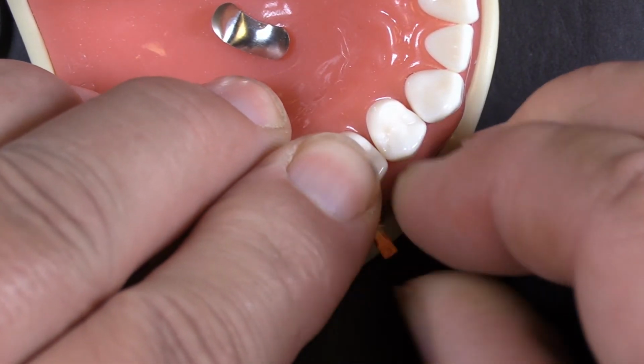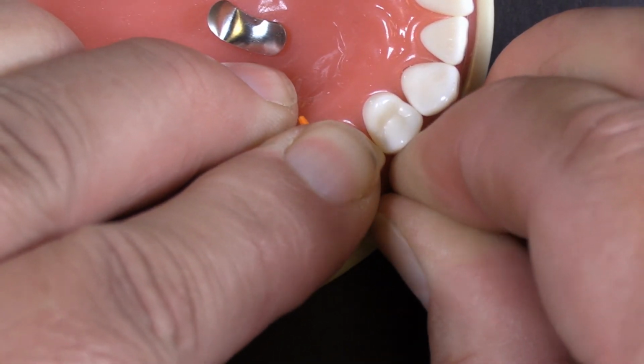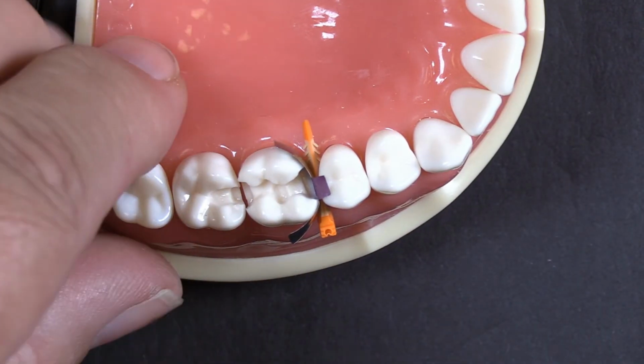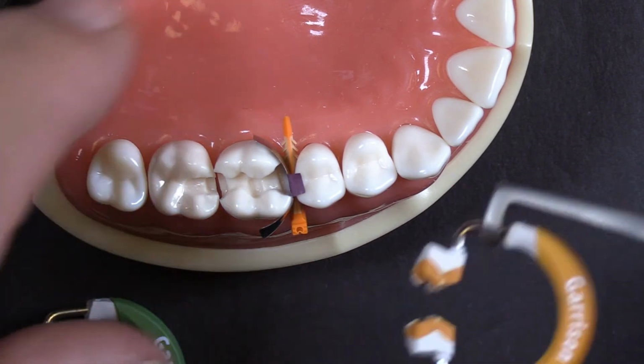There is a wedge, and you see me always putting a finger on top of the wedge when I'm placing that. You will experience the band getting shoved right out of there if you don't. So you want to put a finger on that band as you're placing the ring. Grab the orange tall one here.